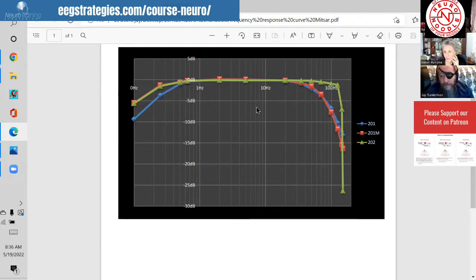Yes. So I can tell from my experience. I started with Brainmaster because I worked with Ron, and this is what he used for years. And at the time, I had an impression that I didn't find a lot of work on this in terms of research, but they really encouraged maybe to use Z-score.